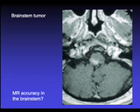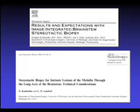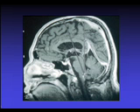Thus, for this brainstem tumor, which eventually proved to be a lymphoma, one images the medullary target, can determine the X, Y, and Z coordinates in that area, and then images the long axis of the brainstem for safe passage of an instrument down through the brainstem. Although this is a longer route, it is safer than going through the inferior cerebellar peduncle, where more blood vessels of the posterior fossa can be encountered.